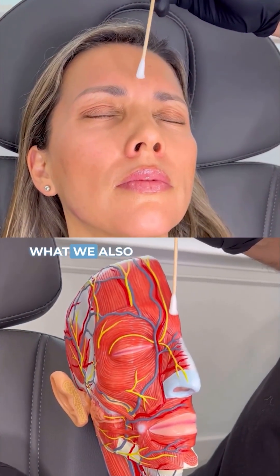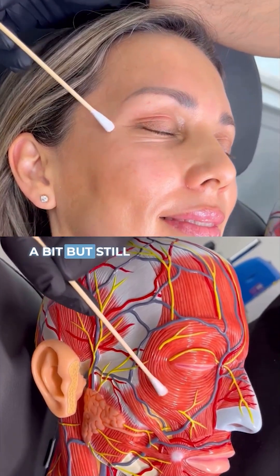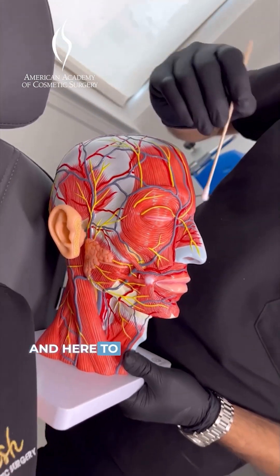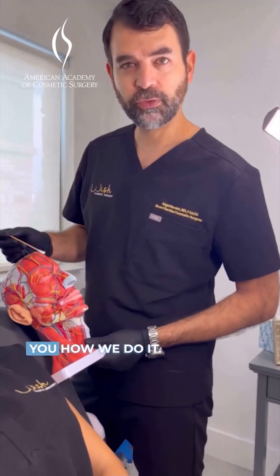In the glabella, what we also call the 11s frown. You can also see when she smiles some of these lines are softened quite a bit, but still extend. We're going to do just very small amounts here and here to touch it up and soften a little bit more, and we'll show you how we do it.